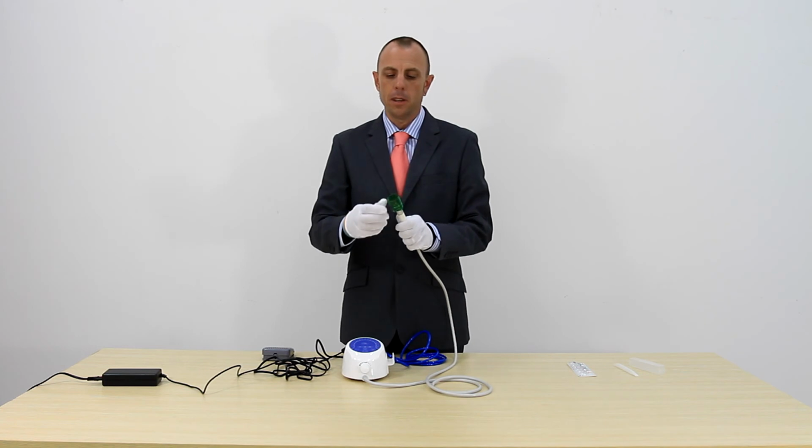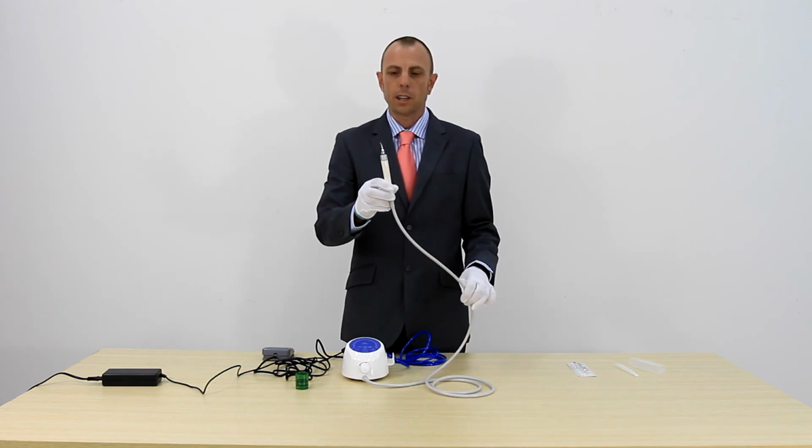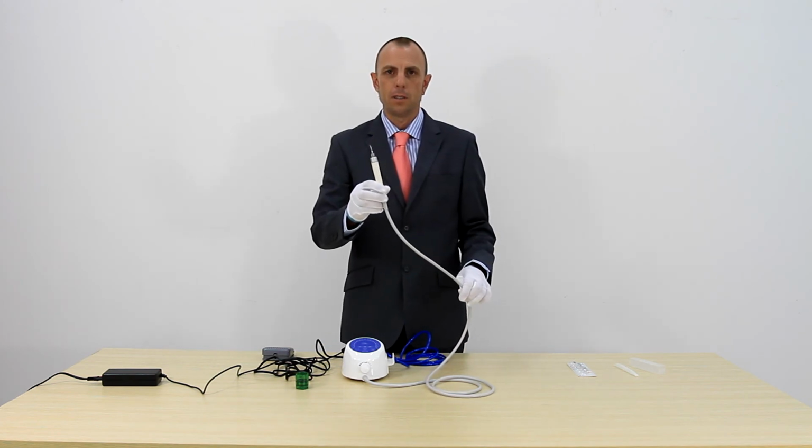Once it's connected firmly then, just pull off the torque wrench, and that's your scaler tip connected to the handpiece, ready for use.